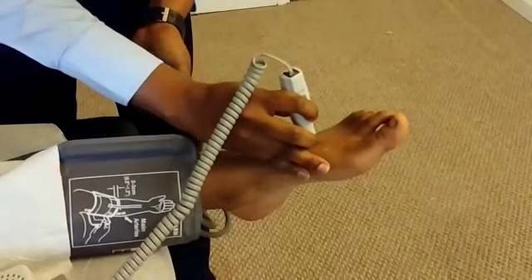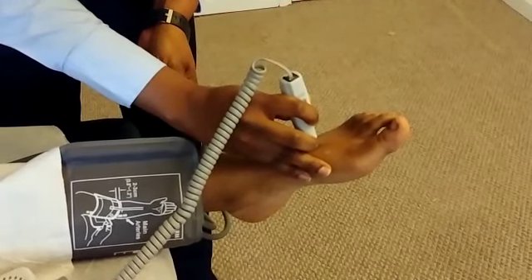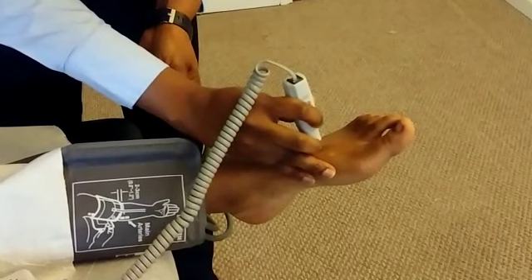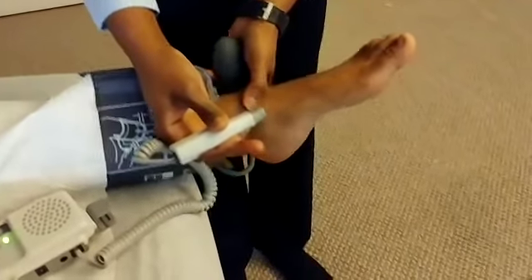Inflated. It went up at about 160. I'm going to slowly deflate. And the first pulse there is 150. I'm going to do the same thing with the posterior tibial.